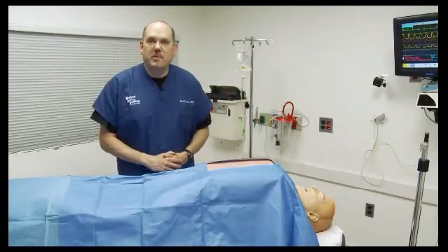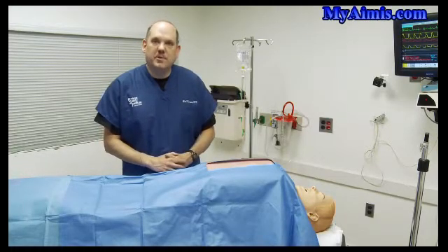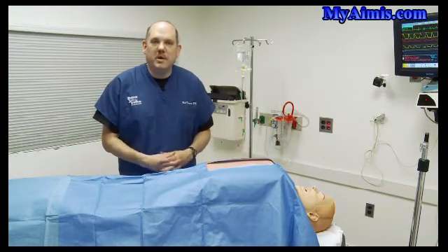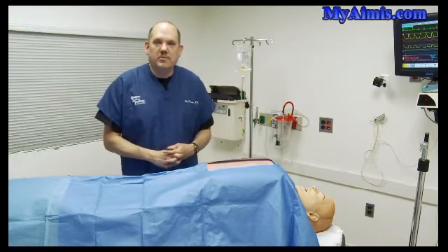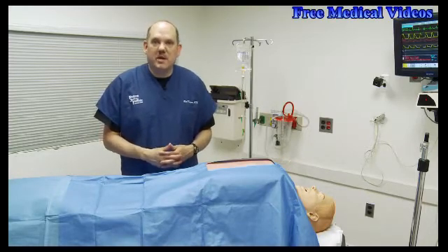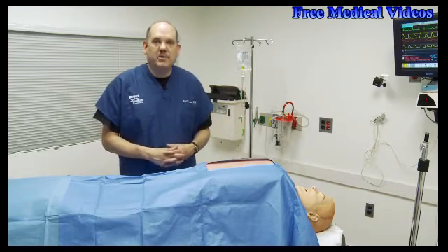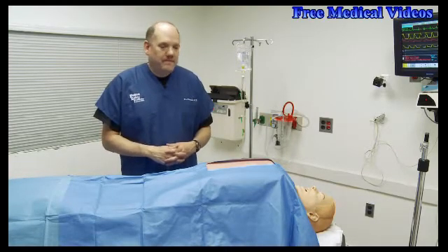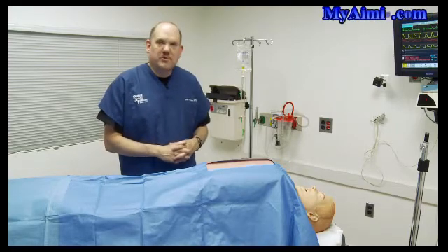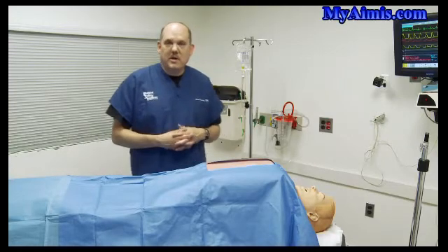Hi everybody. Bob Kerner at the Patient Safety Institute in New York. We wanted to share with our colleagues in the simulation community a little theatrical sleight of hand that we put together to meet the needs of our users. We often get requests to perform surgery on SimMan, and as you know, you can't operate on him without damaging his internal electronics. The particular request was to perform open heart surgery — to crack the chest open in the midst of a cardiac arrest code.